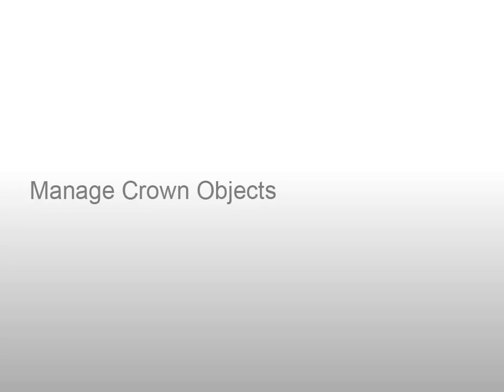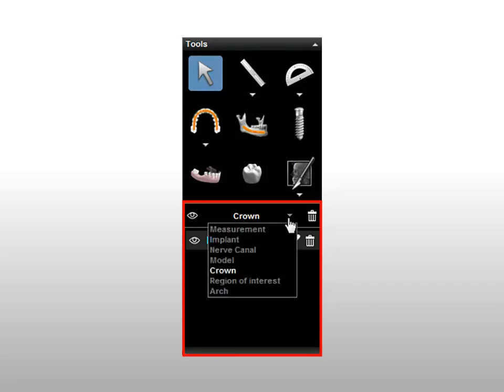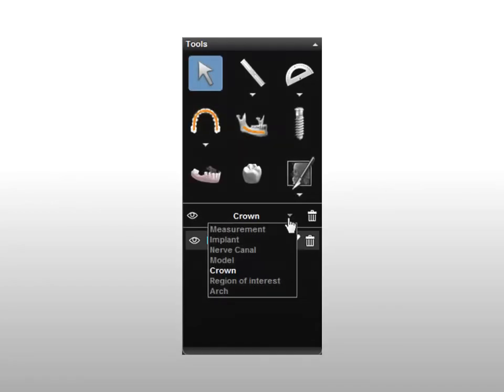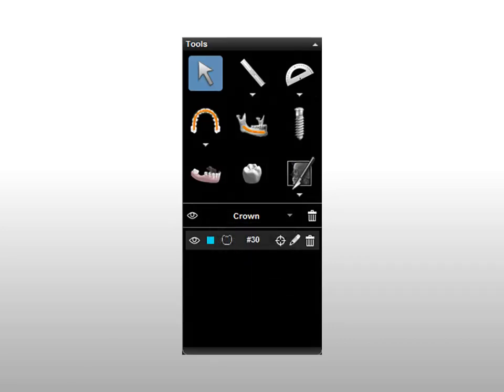To manage crown objects, when you import a crown, it is added to the Object Management panel in the Extended Tools section of the Curve Slicing tab Toolbox. This panel enables you to manage the full range of objects added using the tools. In the Object Management panel, click the drop-down list and select Crowns to display the list of crowns.